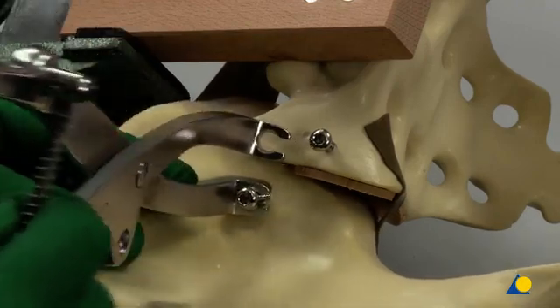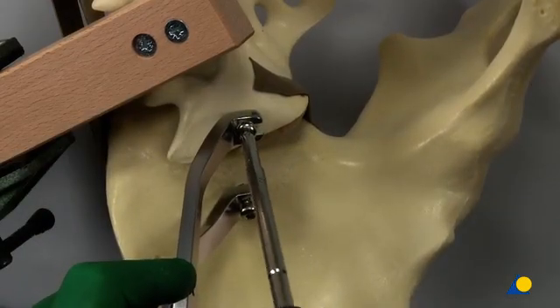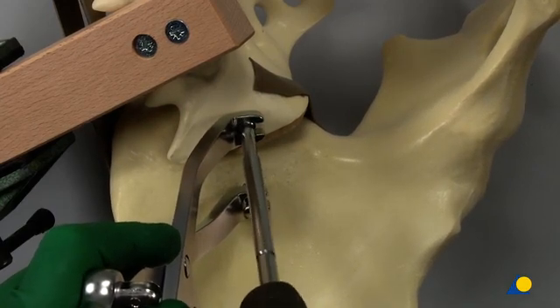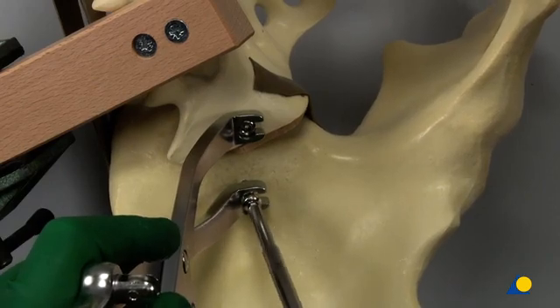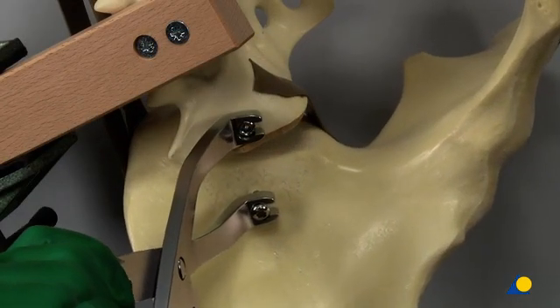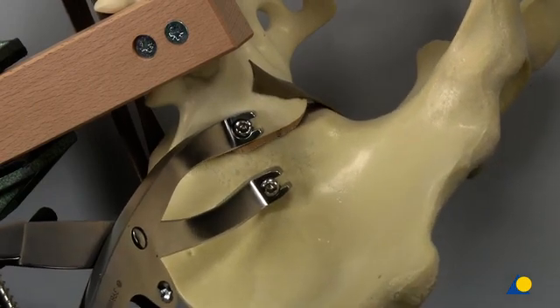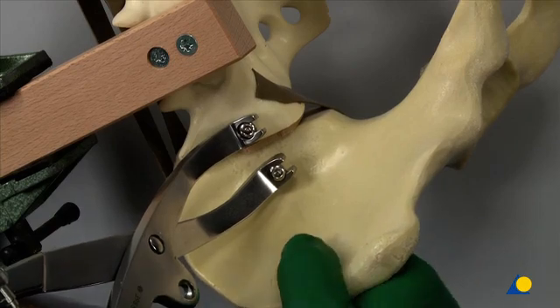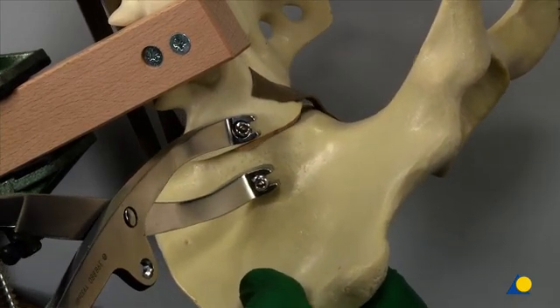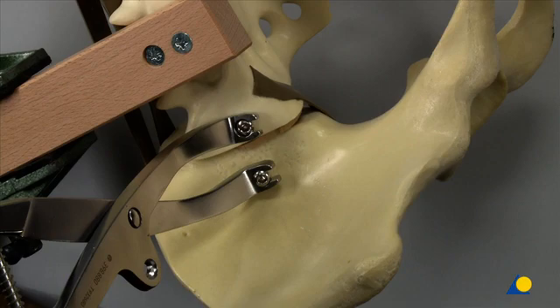Leave the screw heads 5 to 7 mm prominent of the bone to allow the Jungblut clamp to be mounted. Position the Jungblut clamp on the screws and fix both branches of the clamp by tightening the screws. Manipulation with the Jungblut clamp allows reduction of the unstable hemipelvis. Regularly, the displaced hemipelvis must be pushed distally and pulled anteriorly for a correct reduction. Before reduction is performed, a K-wire can be inserted for temporary fixation of the sacro-iliac joint. The correct position of the K-wire can be controlled directly after having distracted the joint using the clamp. With the Jungblut clamp alone, correct reduction with respect to a flexion-extension deformity may be difficult.